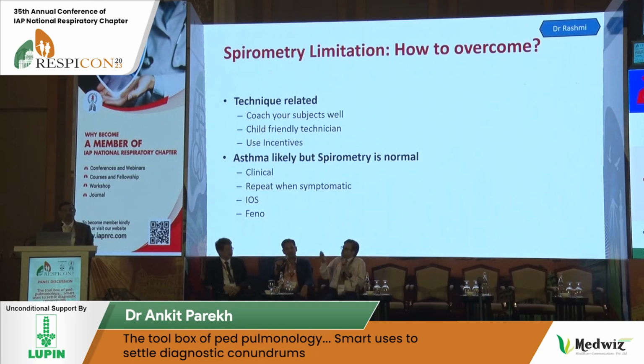Another thing which we do practically is, I bring up the child and show him how another child is doing it. I show him that he has not blown correctly and has to do it correctly. When he sees another child doing it, the child does it the correct way.